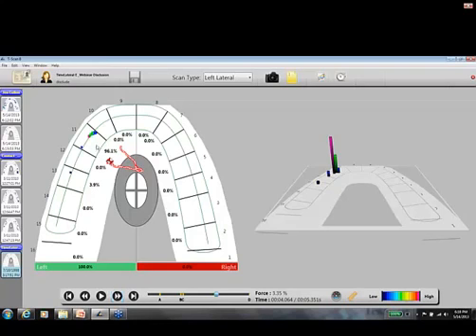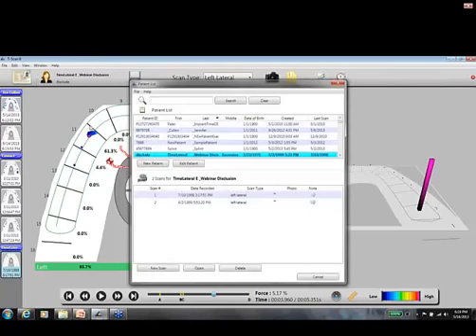If we were to look at our patient's teeth and see that they get canine to canine, we would think, well, they disclude their posterior teeth completely. But what we didn't see, if we weren't using TScan, was that a fraction of a second before that, there was still 34% of force on number 2. When you use it in conjunction with all of the other things that you're using in your practice to look at this, it becomes extremely valuable.